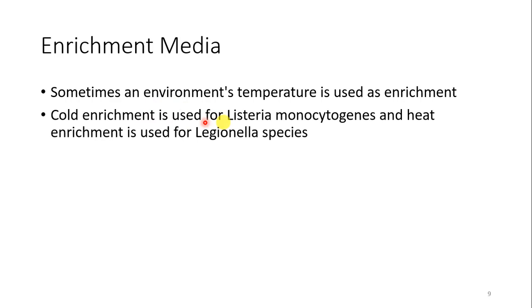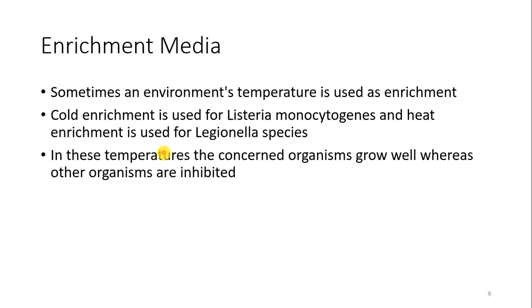Cold enrichment is used for Listeria monocytogenes, whereas heat enrichment is used for Legionella species, because these microbes grow well under these conditions and other normal biota are inhibited.